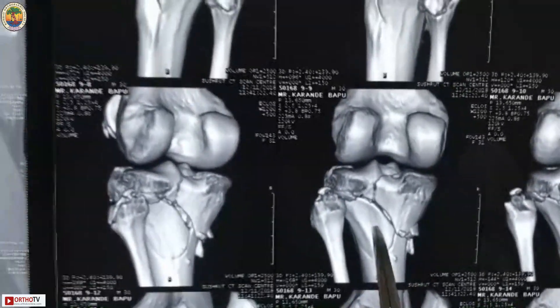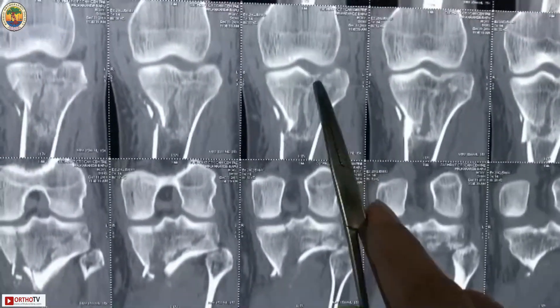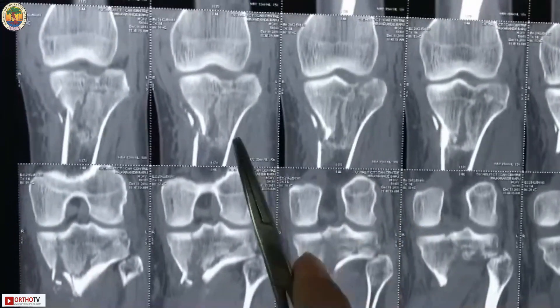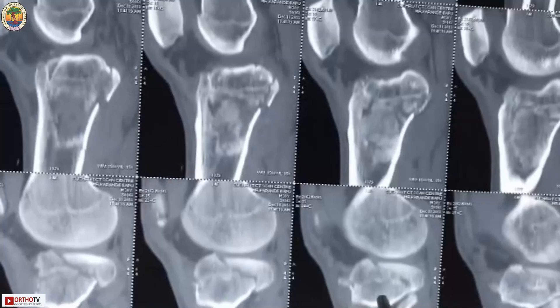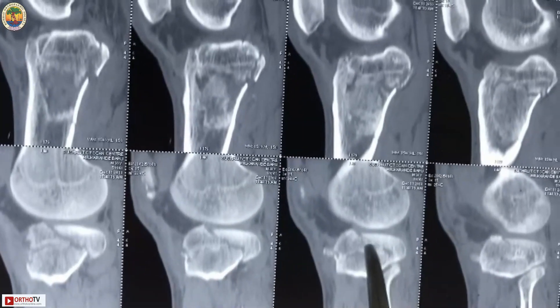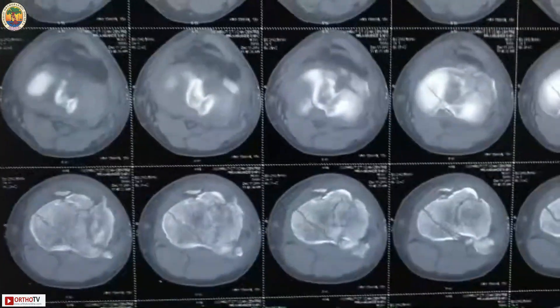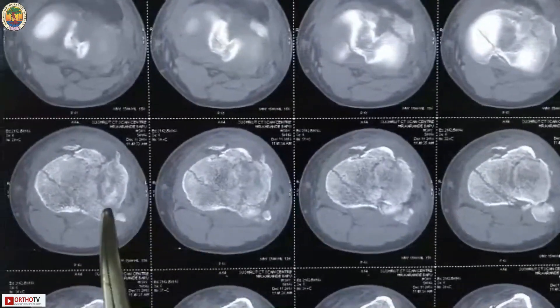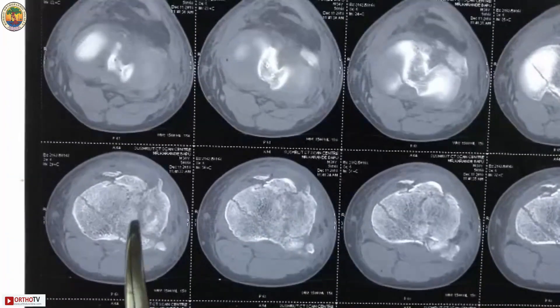There is also an undisplaced fracture of the posterior wall of the upper end of the tibia. On 2D CT scan, the lateral condyle fracture and medial condyle fracture are visible. In the coronal and sagittal planes, the coronal plane fracture of the tibia is clearly seen. The axial cuts help in planning treatment.